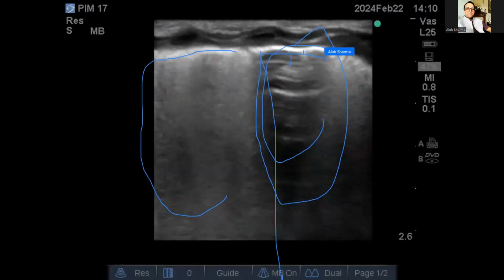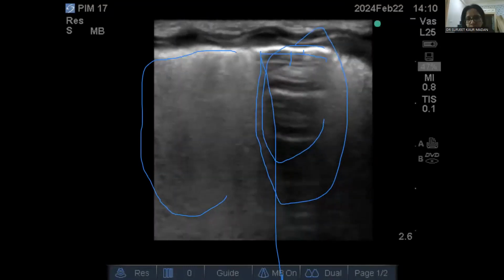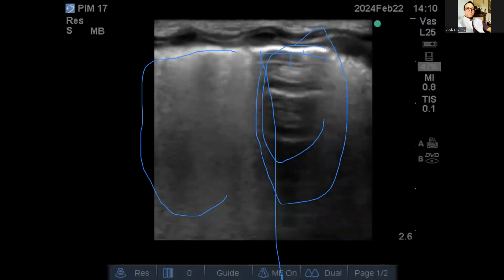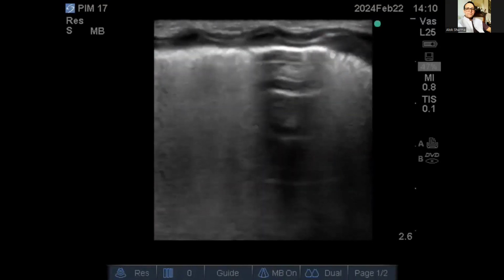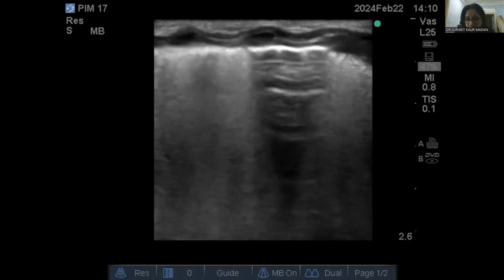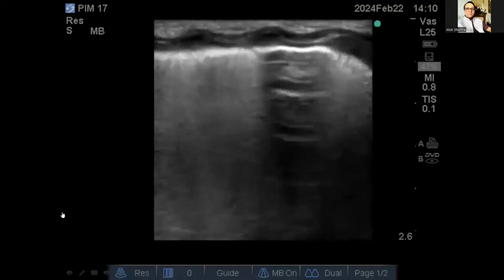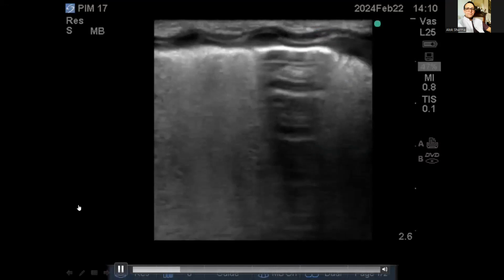Now, just remind me, is this baby intubated? No, it's on CPAP. And you haven't done LISA yet. No, I had not done it at that time. I have not given it yet because of some reasons. Yeah, it's just an area that's better recruited. And usually what I'd say is the right anterior areas tend to recruit a little bit better as compared to the posterior areas if the baby is supine.